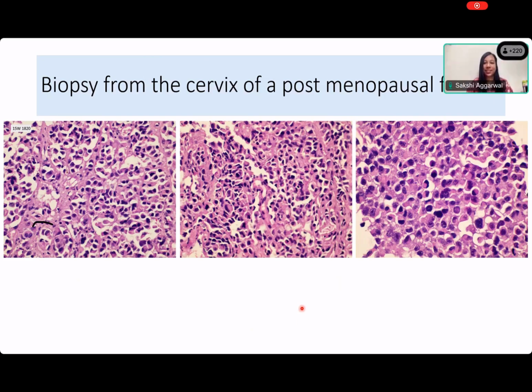I didn't say signet rings. Oh, you did. Who said it? Aradhana? No, ma'am. Then? Ma'am, I said signet ring. Yeah, so come on then, show me. Ask for annotation. You're showing the signet rings. Where? Have you asked for annotation? I have marked it. You have marked it over there. Okay, so that's your annotation over here.